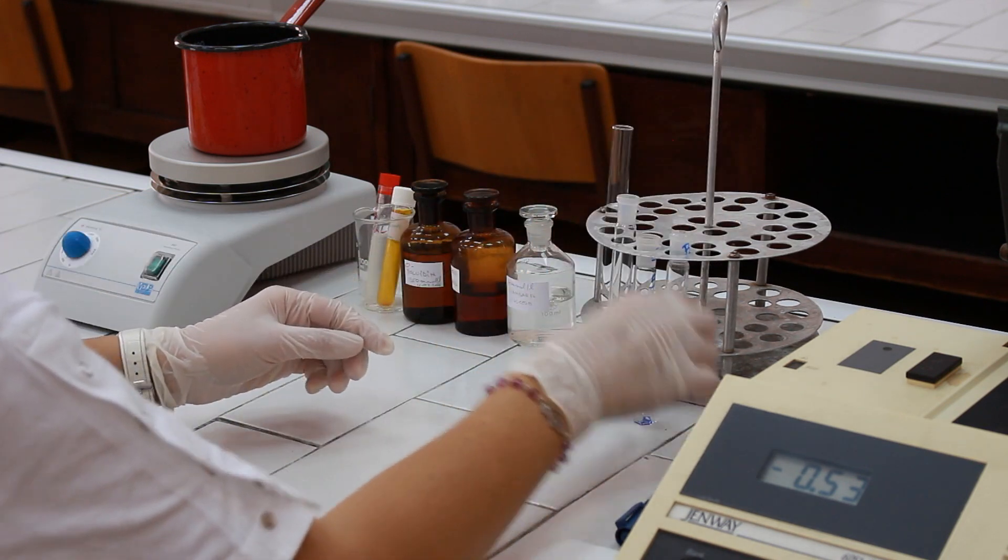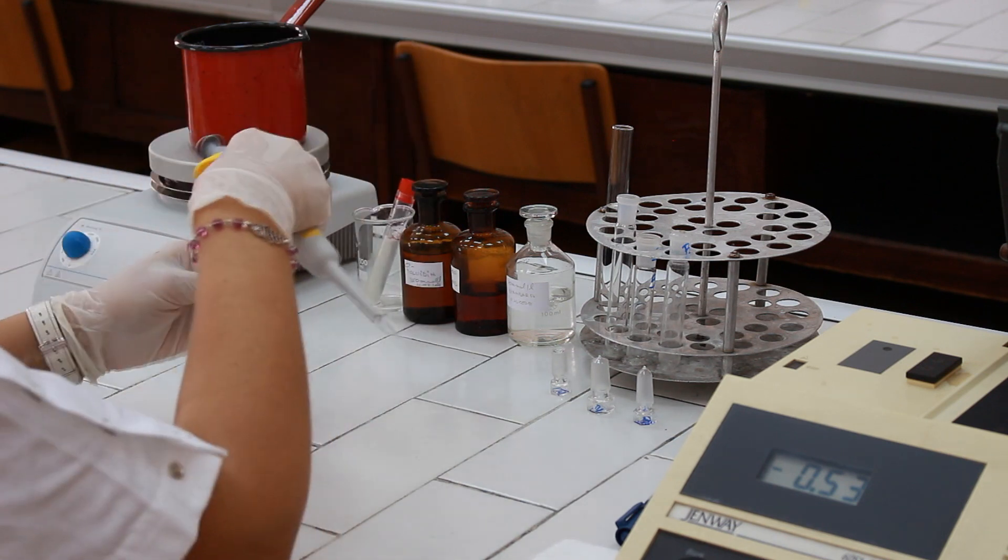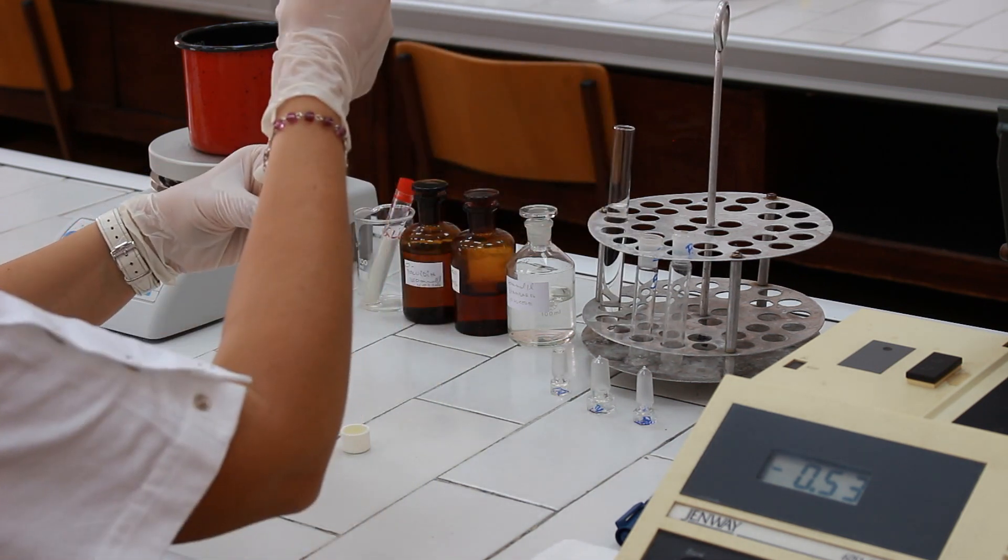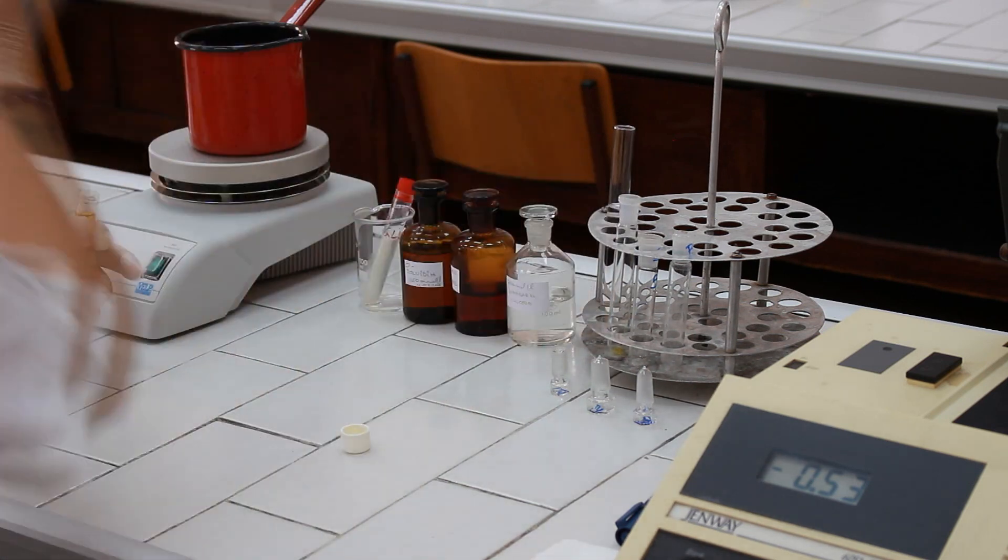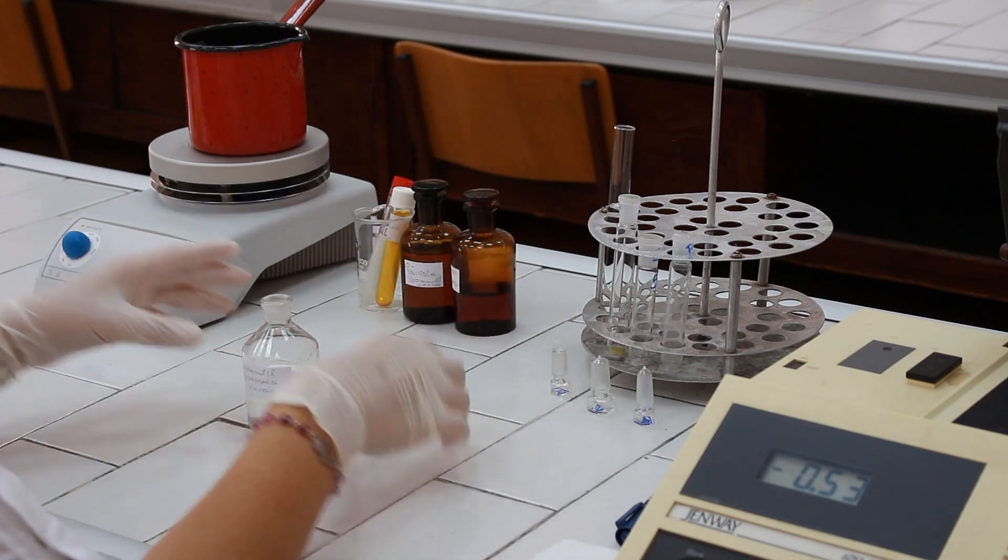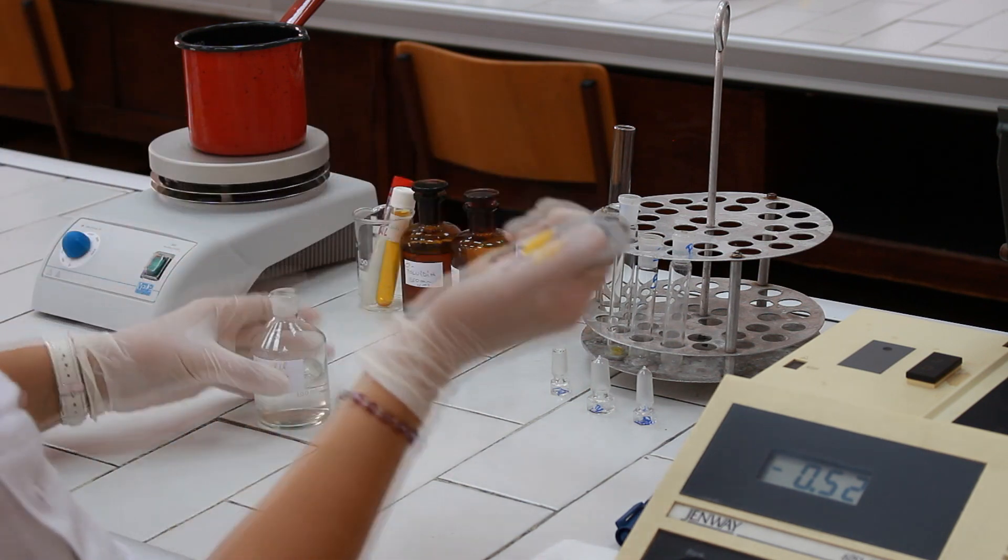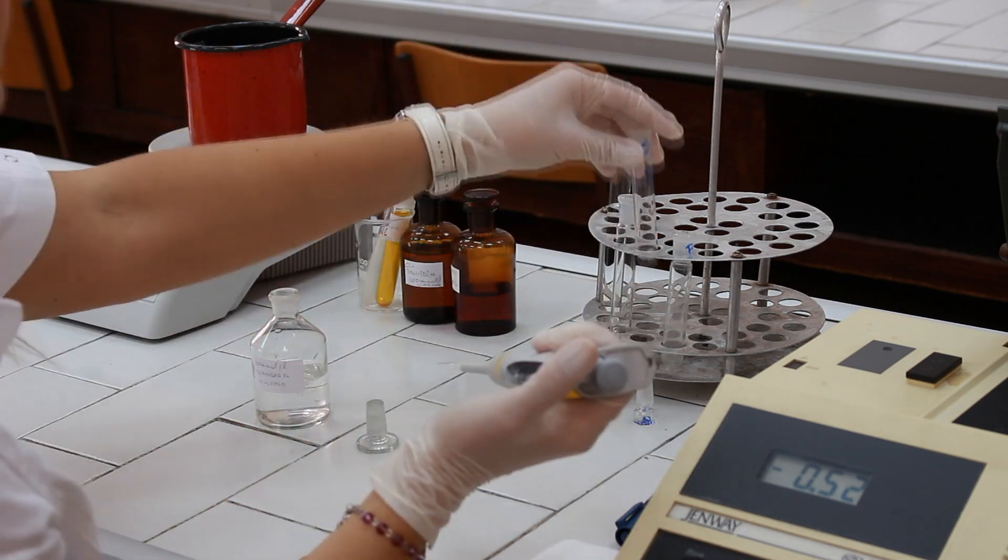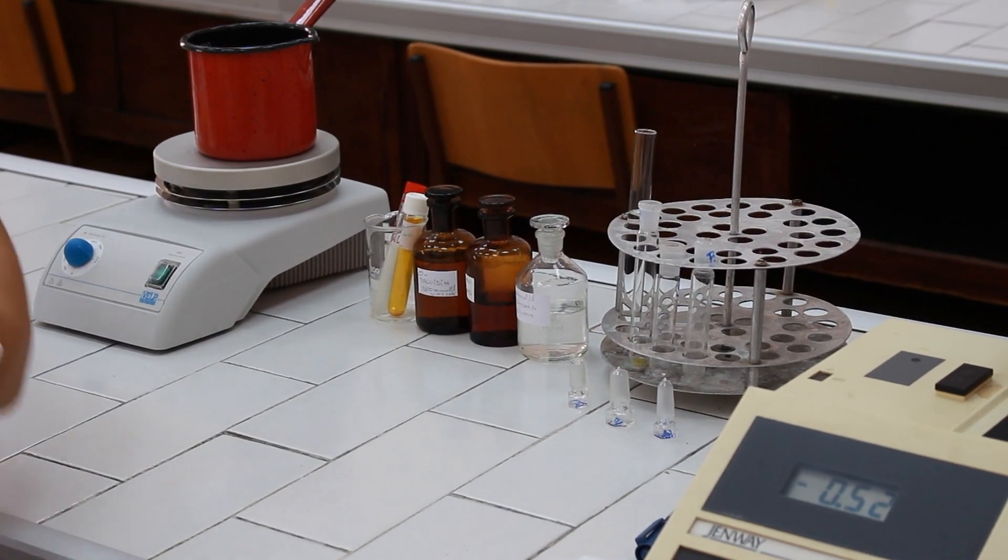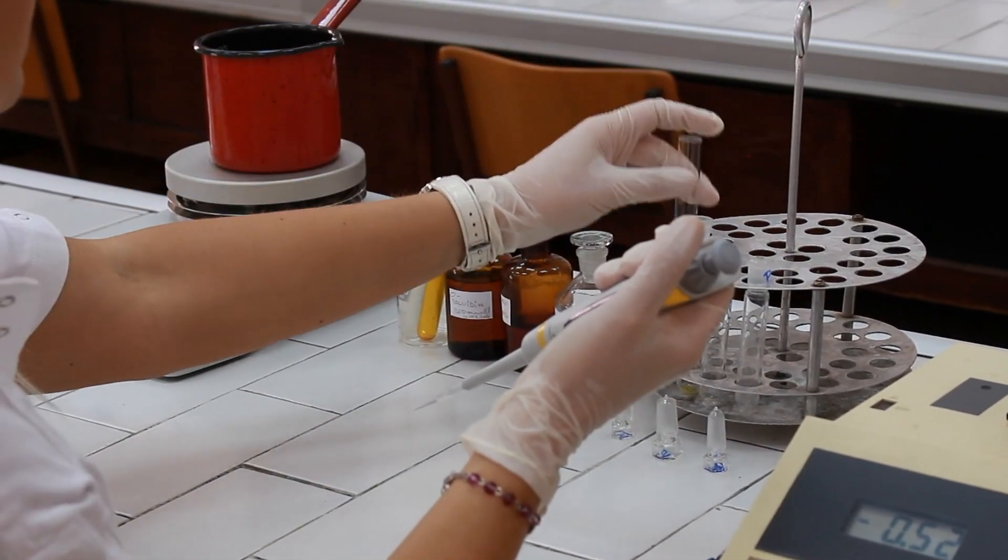Now we need to pipette 50 microliters of blood serum to the test tube T. Then, standard solution of glucose, 50 microliters in test tube S. And distilled water, the same volume, 50 microliters, in test tube blank.